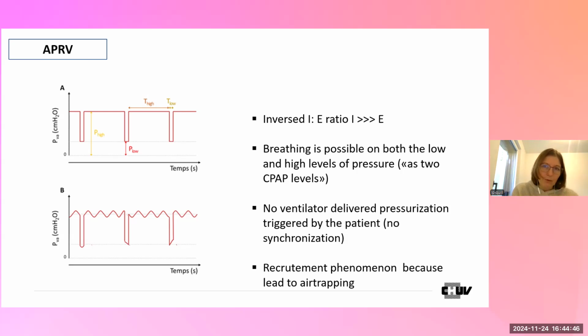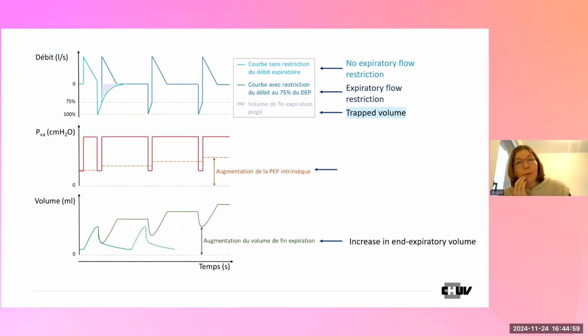And with this type of mode, because you have a very short time for expiration, you generate some amount of auto-PEEP, and you thus have some recruitment. Be careful, because you still have to avoid too much auto-PEEP, and it's just important to understand that.